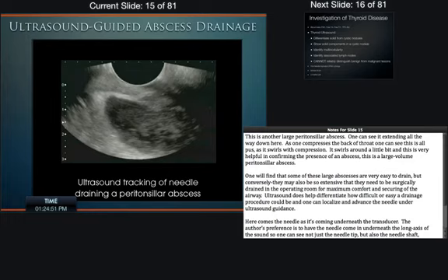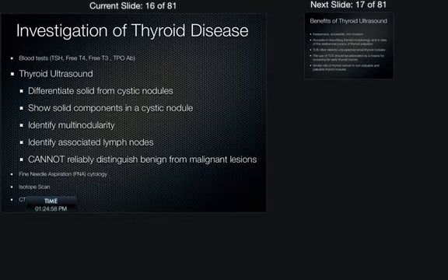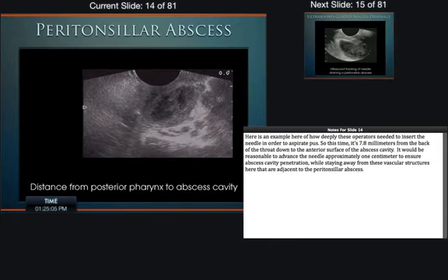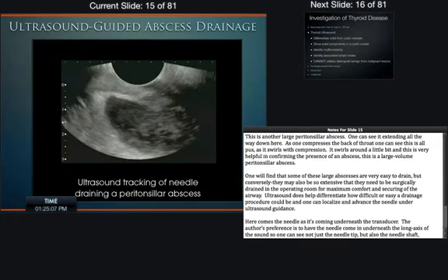This next example that we're going to see is a very large abscess here, and as we push the probe, put a little pressure on it, we can see this material swirl. Wait for it, here we go. So we can see this material swirl as we gently insert the probe a little bit further. Can you see it move a little bit? This is all pus back here that does that.